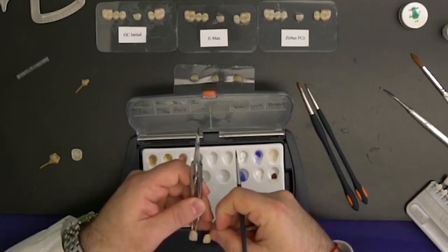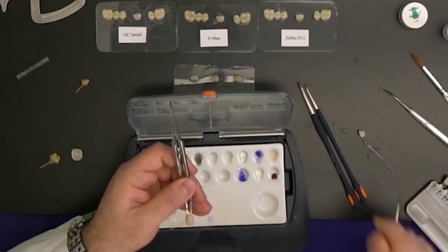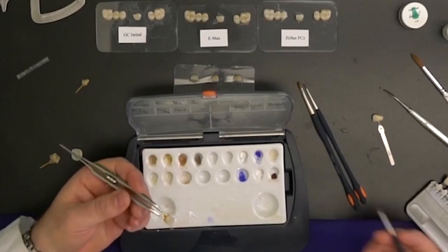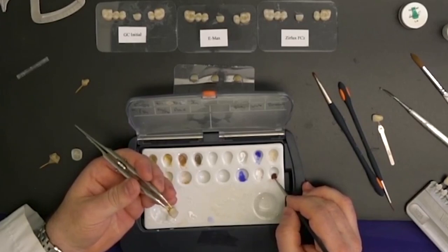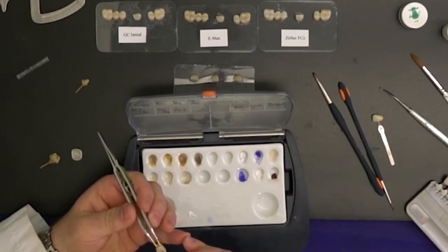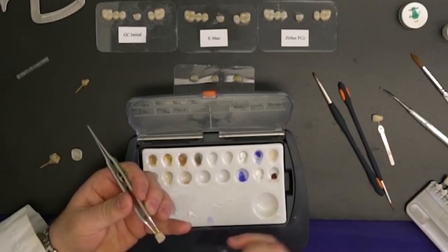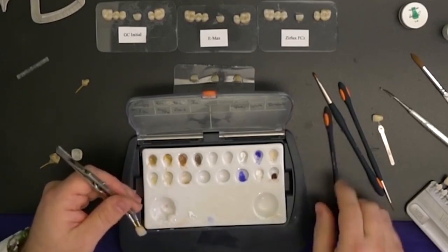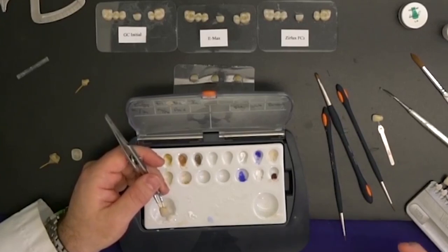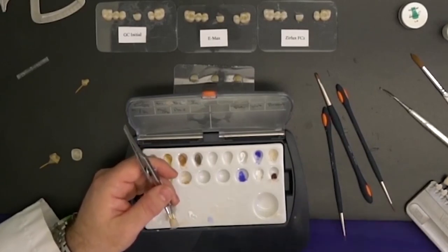Then of course you would match it to the shade guide to make sure it has the right value as well as the right chroma. Typically, rarely do I get just a straight A3 — there's always some kind of custom staining. I can also put a little bit of brown stain in the pits to really pop them out and make it look as natural as possible. The lingual fossa is more chromatic than the labial, so you want to deliver that as well. Then I would fire it one time and check whether the shade I'm trying to attain has been met — if not, you may have to do a secondary bake.